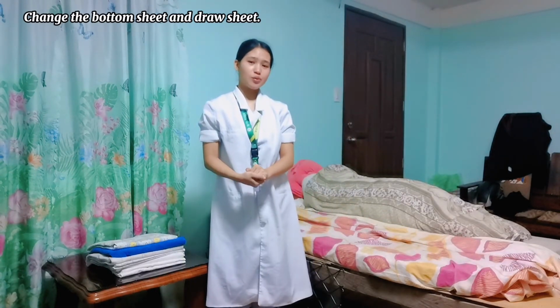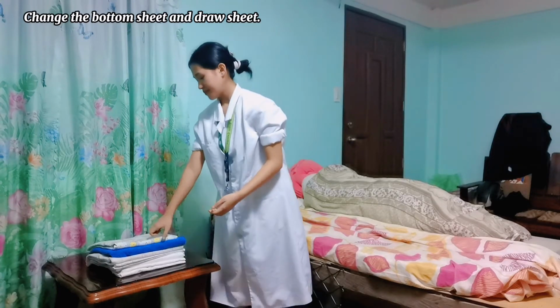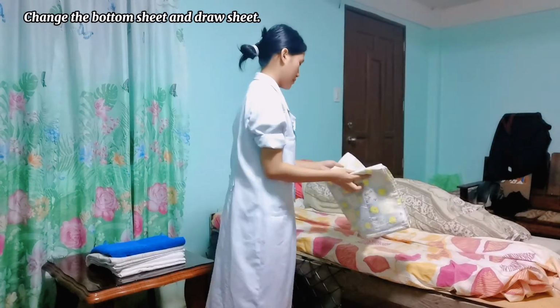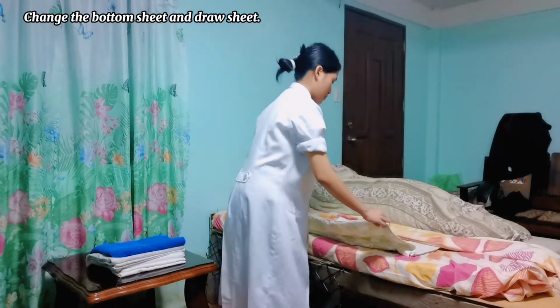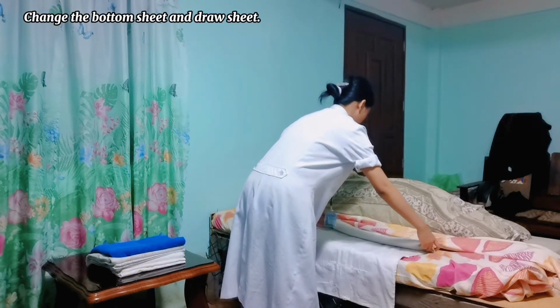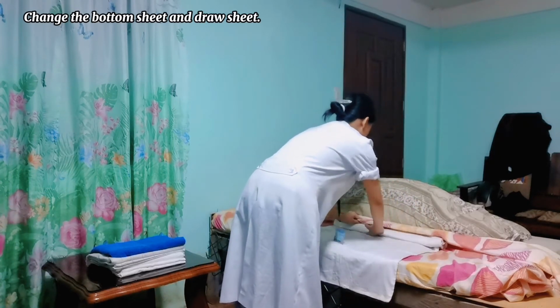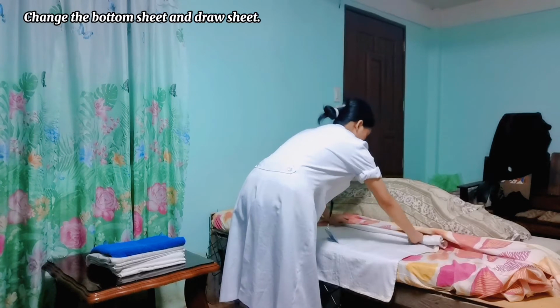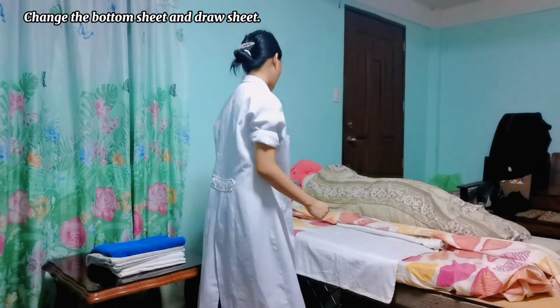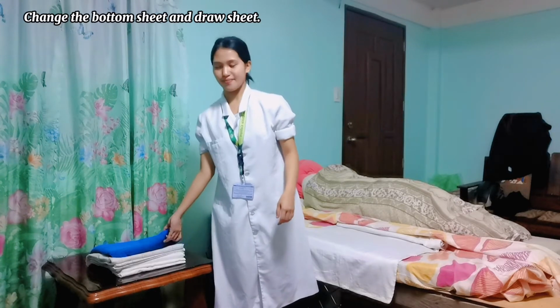And then the next one we will be putting is a rubber sheet. Also fan fold it. And then the next one is the draw sheet.